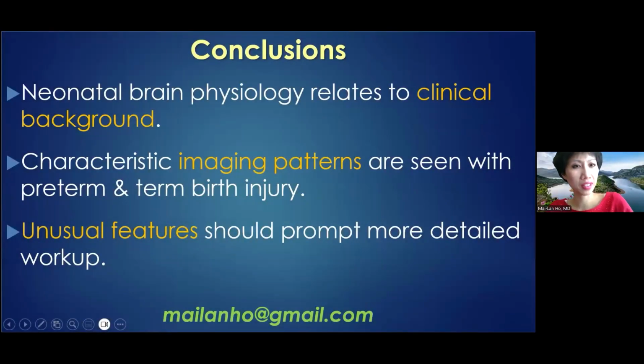All right, so that's everything. In conclusion, neonatal brain physiology is very dependent on clinical background. So always look at the notes and try to correlate when you're reporting a case. There are characteristic imaging patterns with preterm and term birth injury that we've described, so recognizing and being aware of those is very important. And then any unusual features, all those rarer cases we just went over, should prompt a more detailed workup.